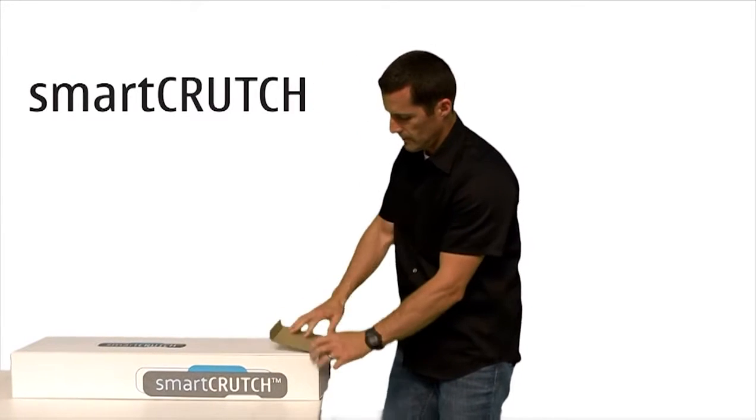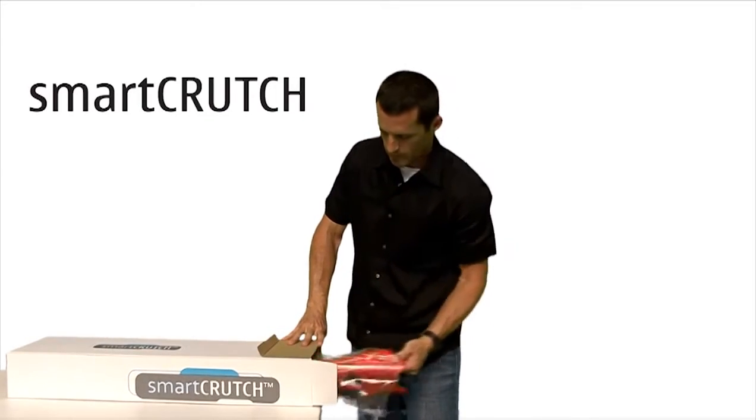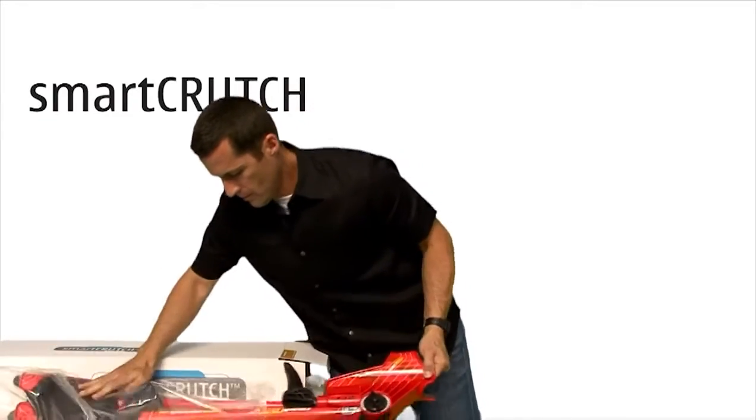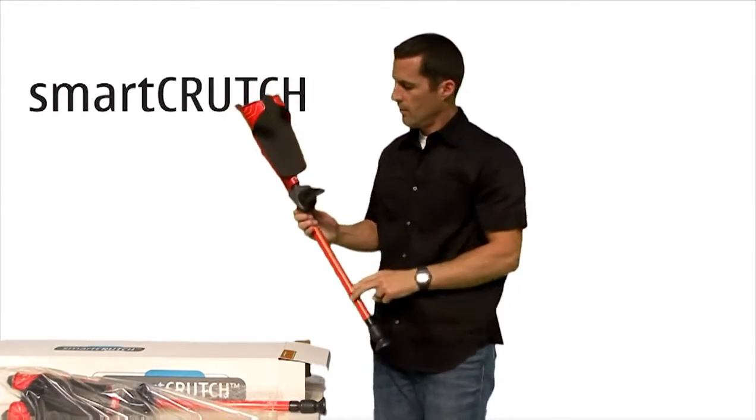How to set up your smartCRUTCH. First, remove your new crutches from the box and packaging. You will notice that each crutch is individually marked just above the grip to indicate left or right side.